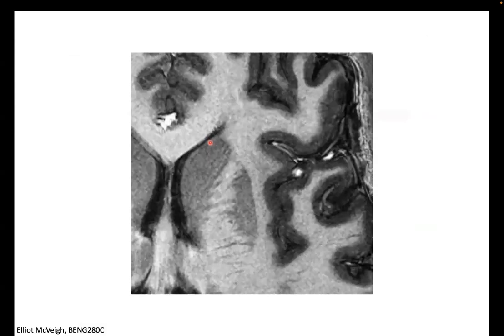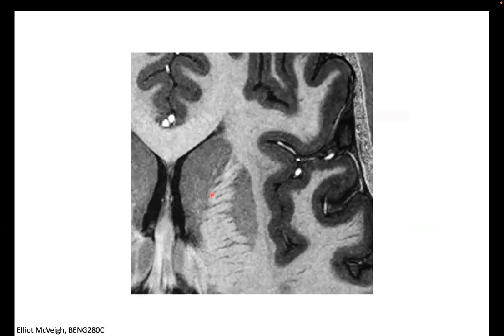This is just demonstrating extremely high spatial resolution. This is a tiny slice of the brain. And if you look at the details we've got here, what's going on is non-motion corrected versus motion corrected data.